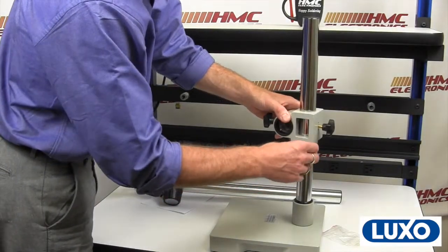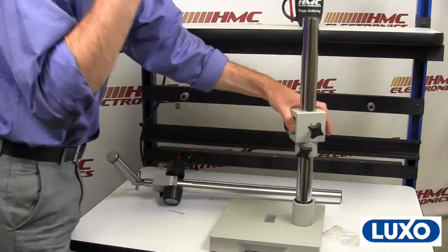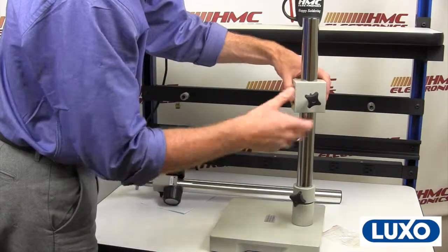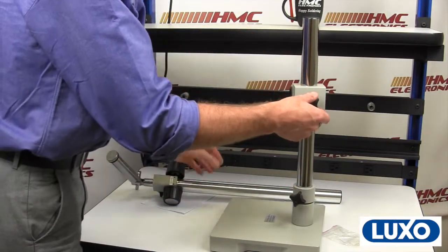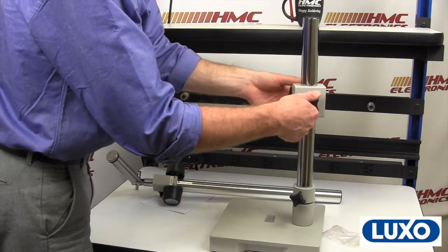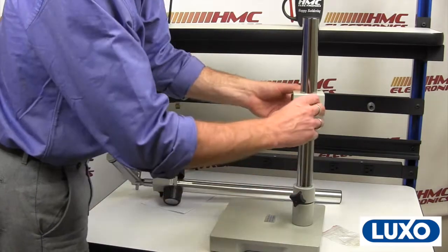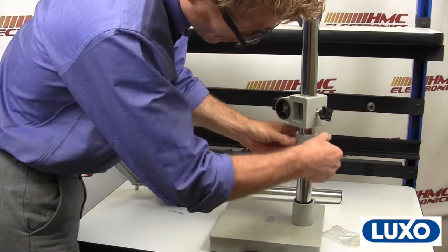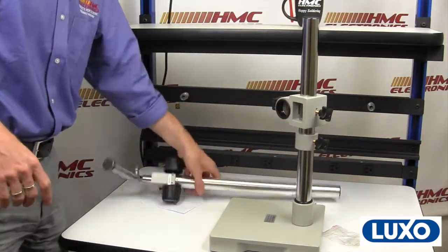The importance of this collar cannot be expressed enough. In setting up your microscope you're going to need to do some vertical adjustment. If you don't attach this, or if you just leave it down here, and your operator goes to make an adjustment without being aware of the weight of the horizontal bar and microscope, as soon as they loosen it, it's going to come crashing down. So your locking collar should always be very close to your cross block.